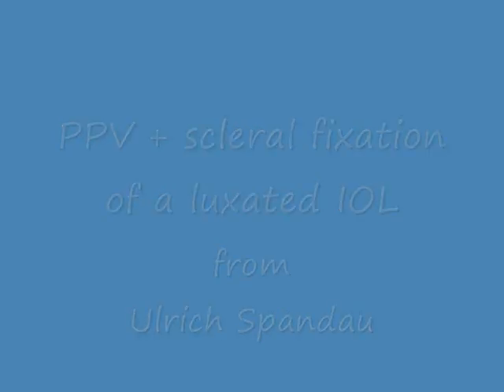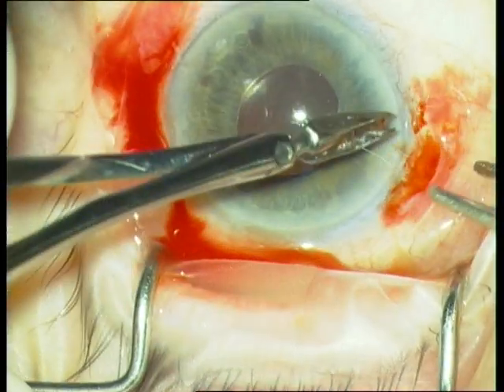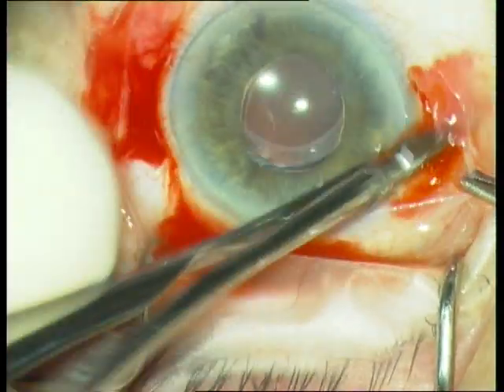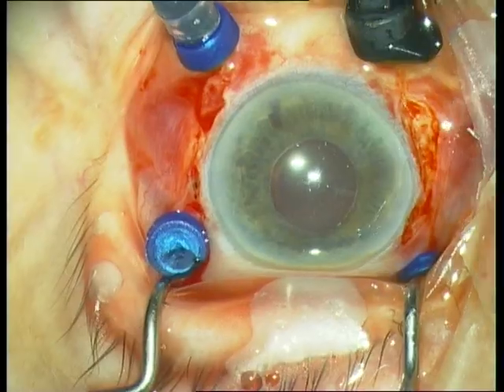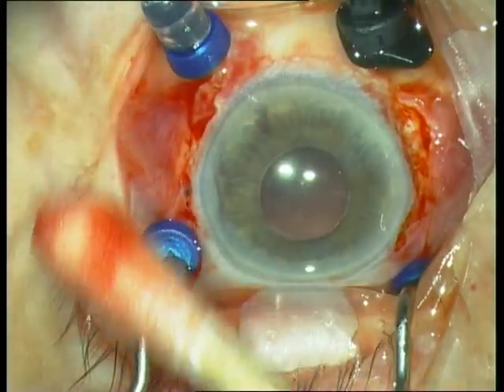I will show the management of a luxated IOL. First we perform a limbal peritomy at 3 o'clock and 9 o'clock. Then we insert the trocars and a chandelier light.